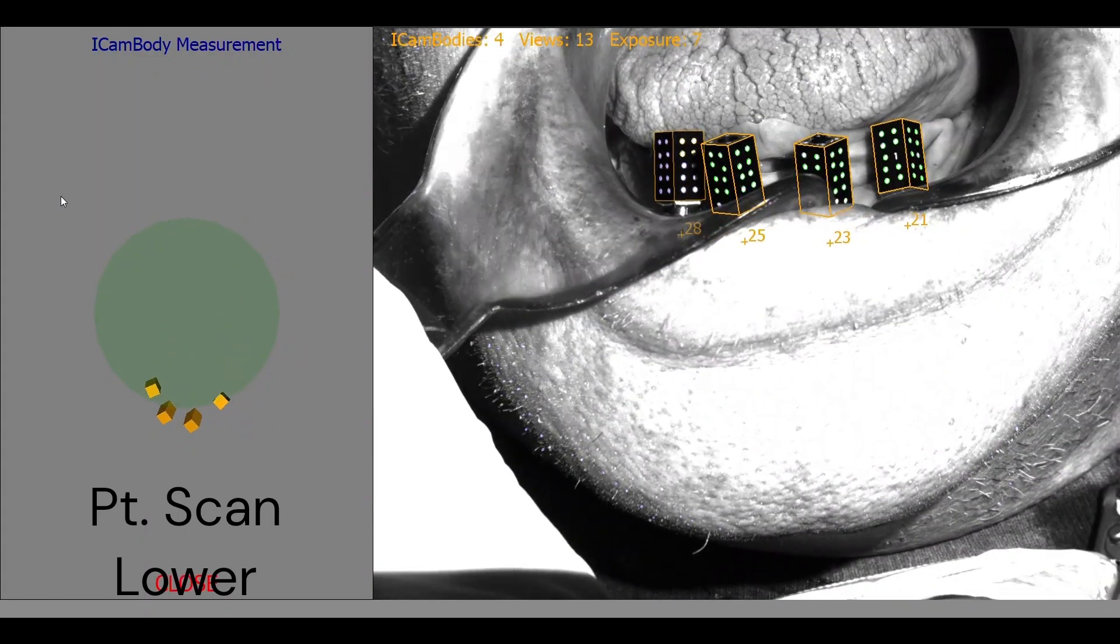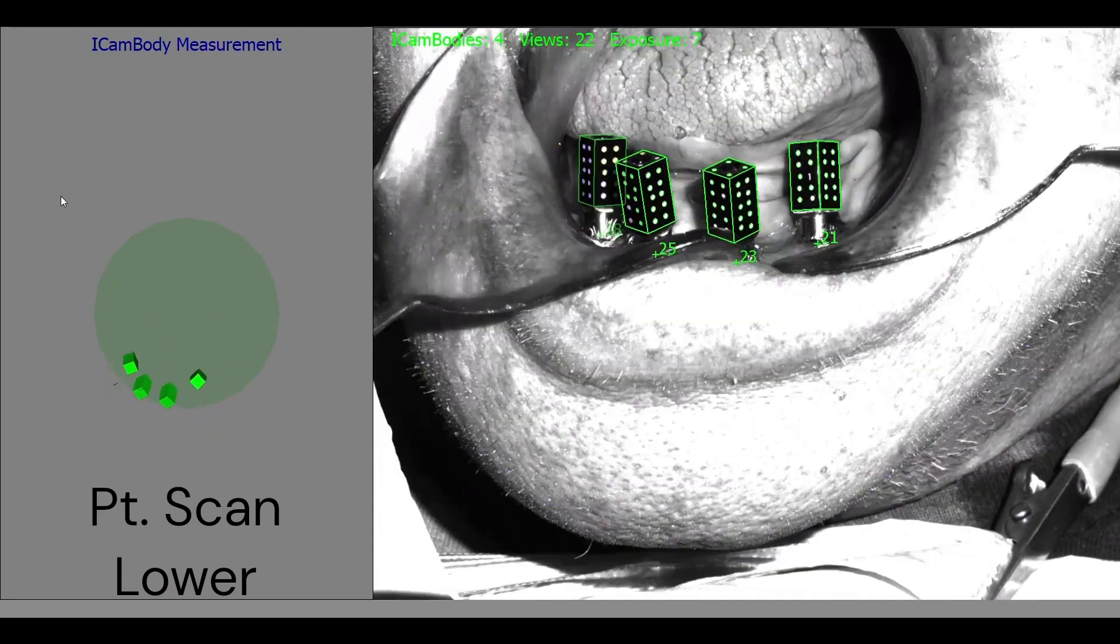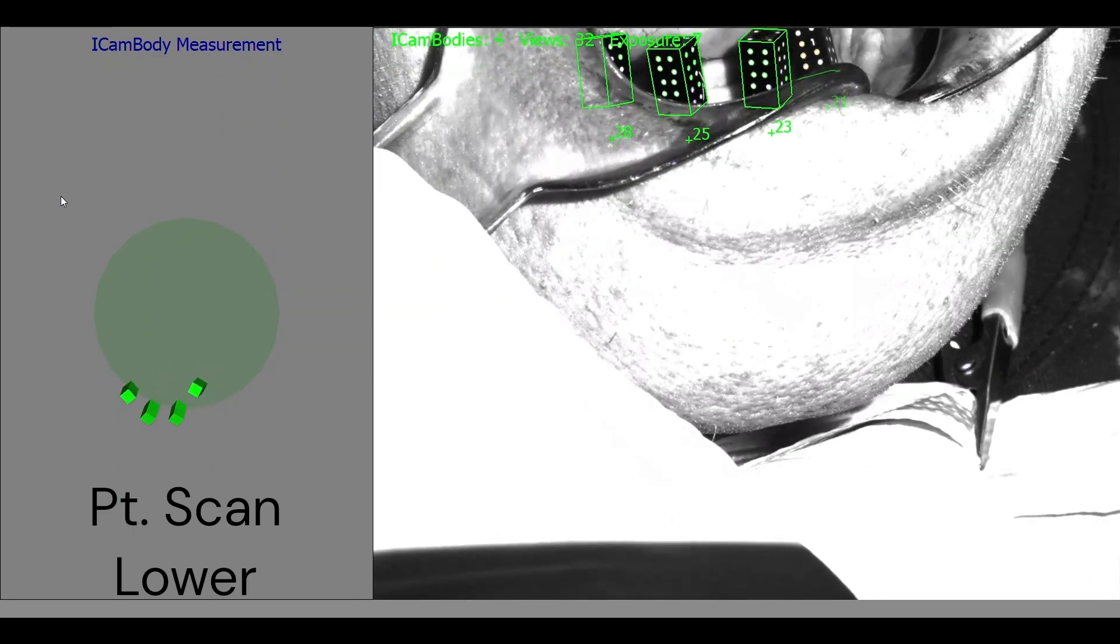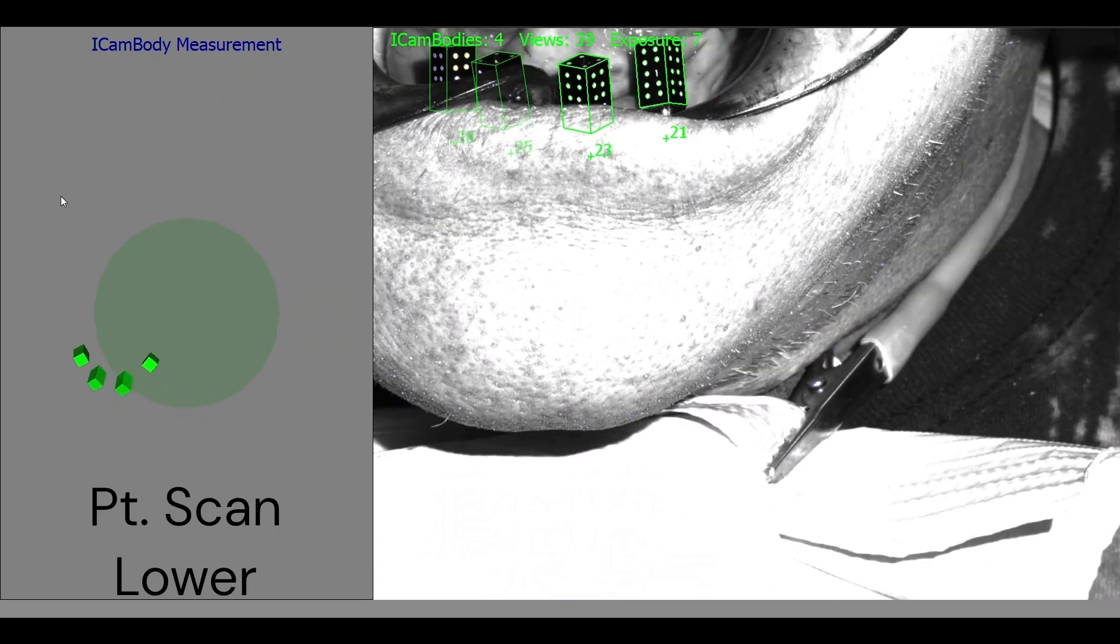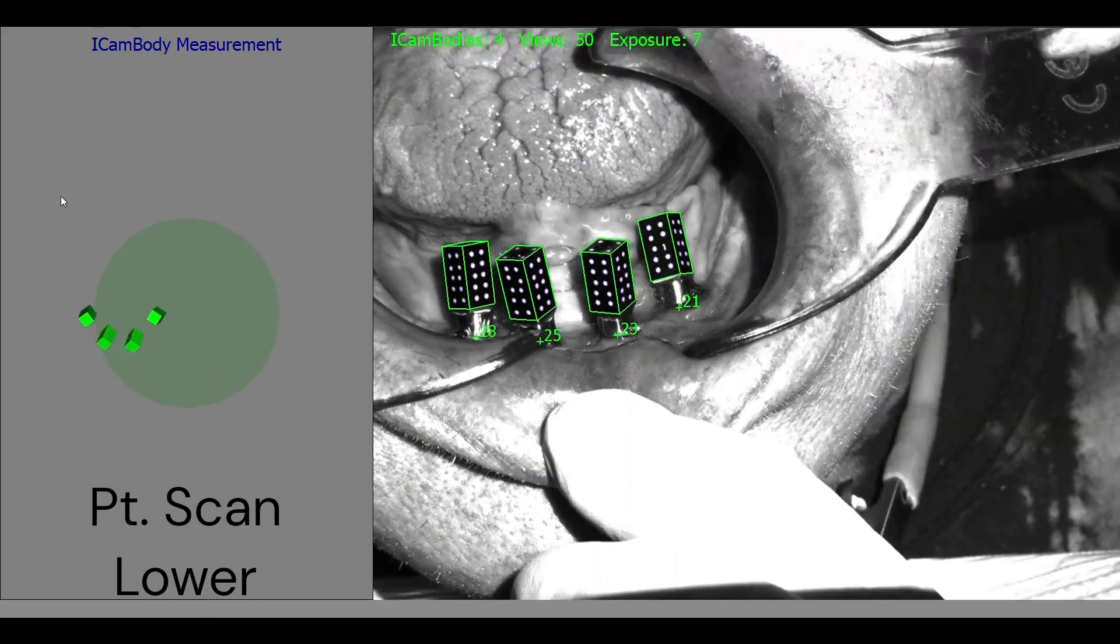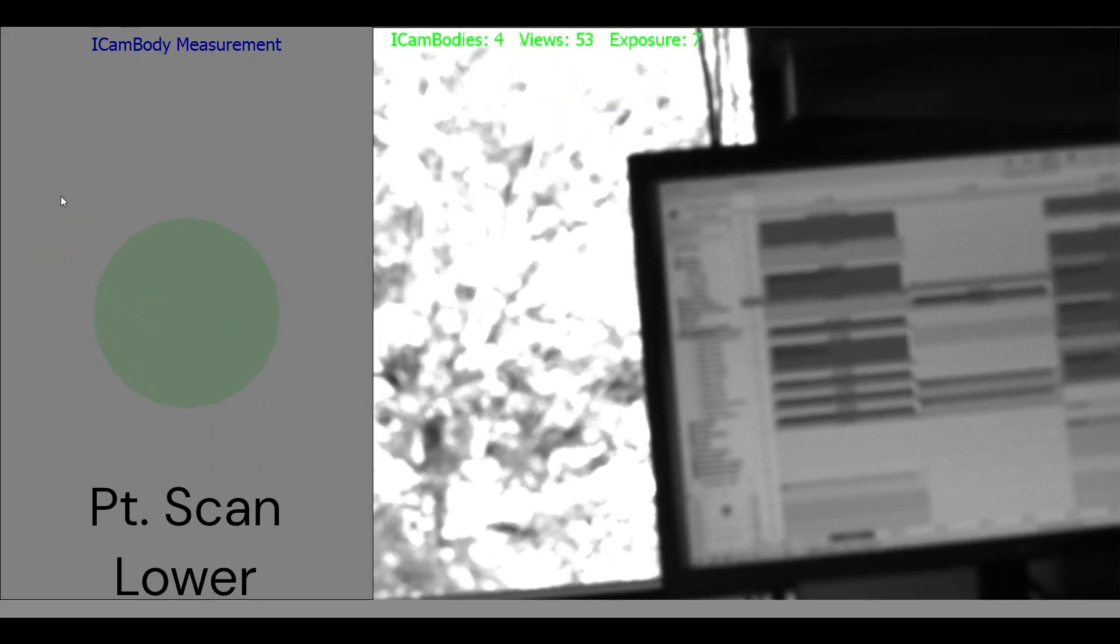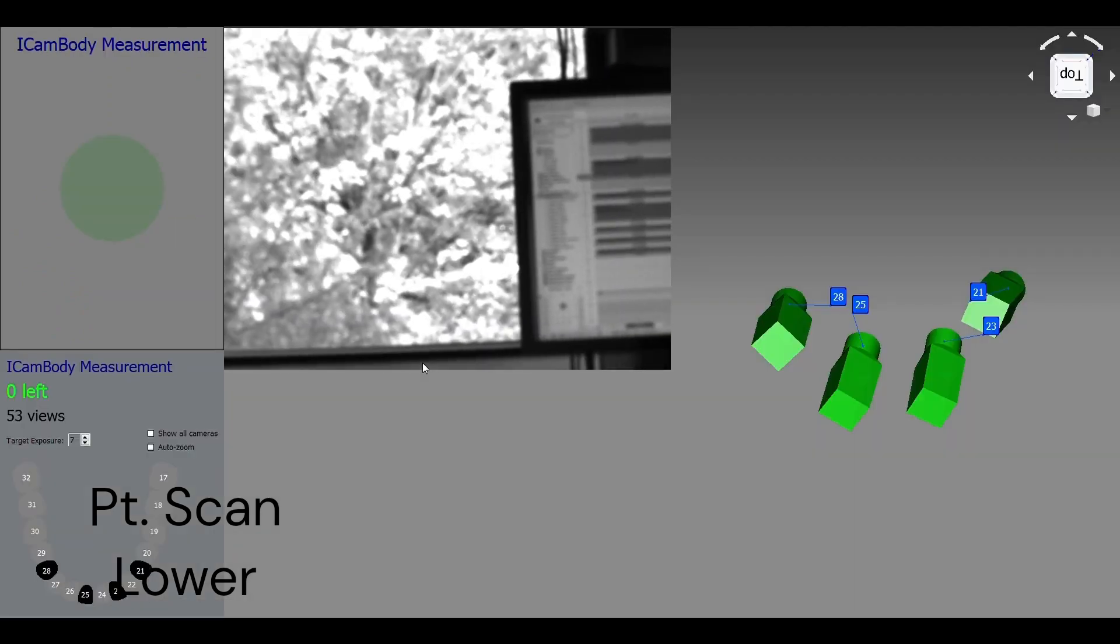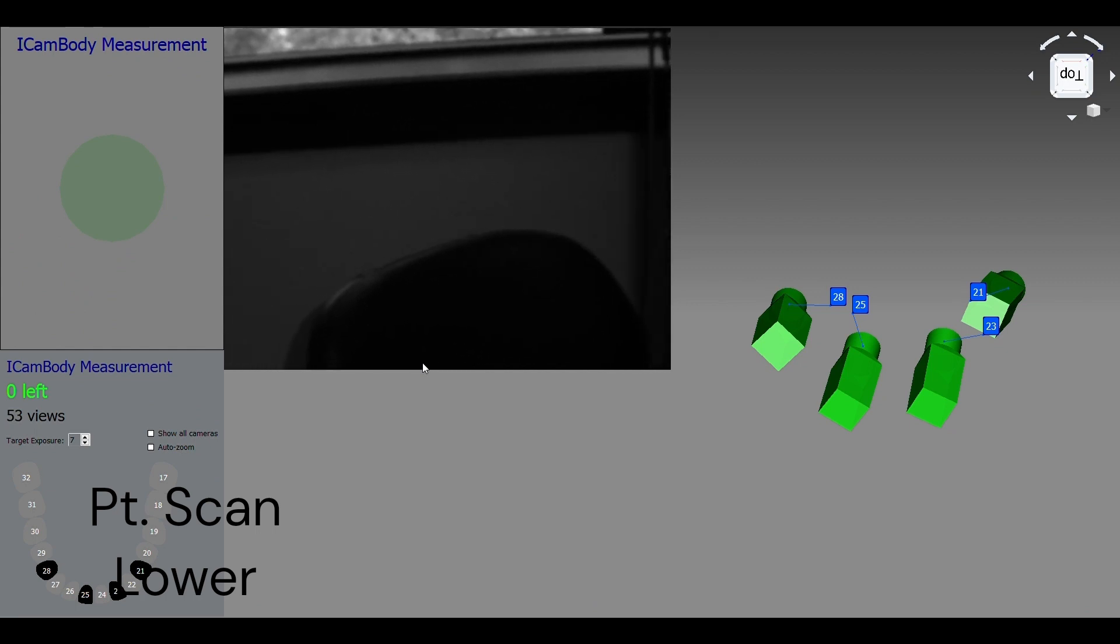That's a good sound. So you want to try to get up to 50 views. You're at 29, 30, 31. All right, let's try to get up to 50 views. And it's green. Everything's good. All right, hit that check mark.